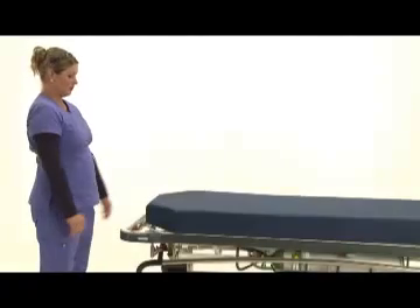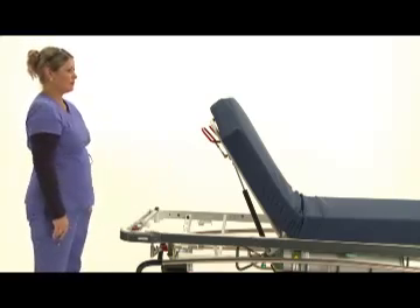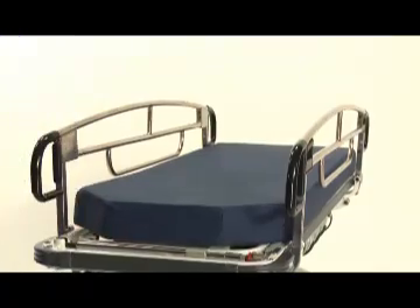The 7500 comes with a pneumatic fowler to assist in the raising and lowering of the patient. The pneumatic fowler offers 600 newtons or 135 pounds of force, so even small or petite caregivers can easily elevate or reposition a patient.